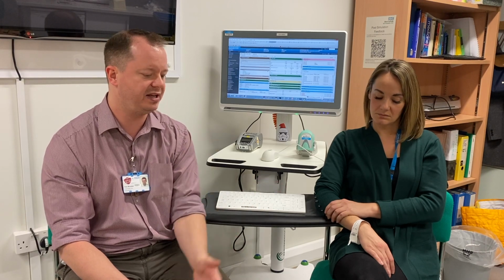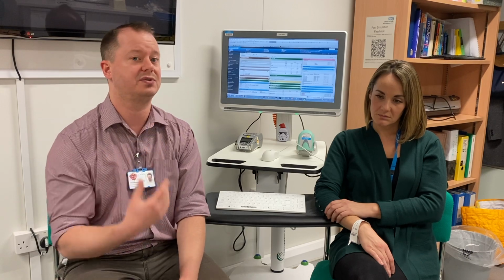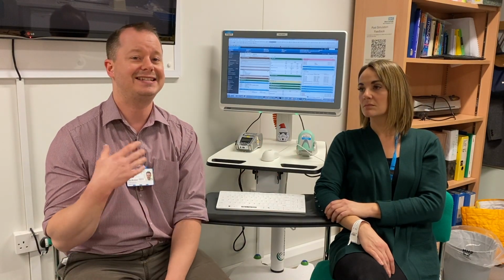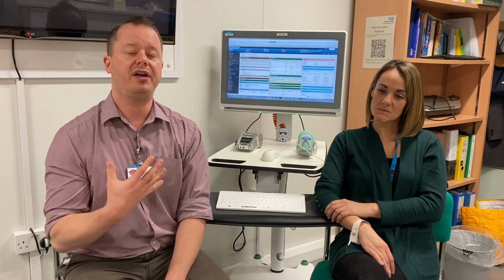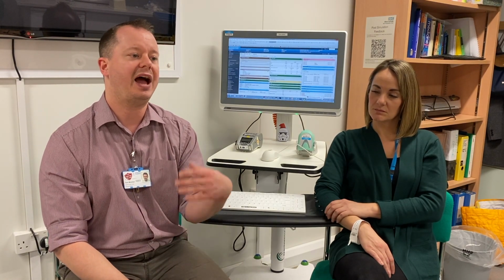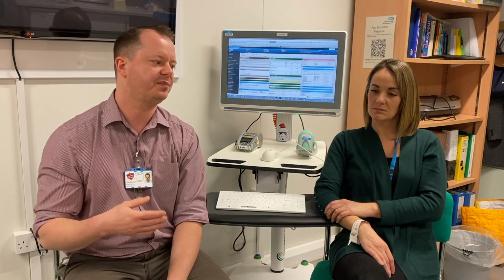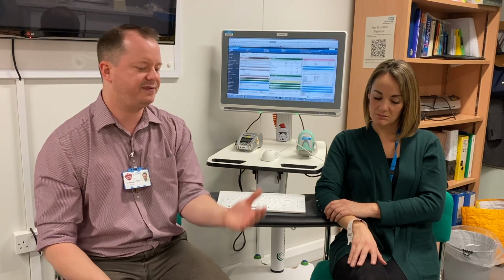If you are going to be trying to perform any practical skill, you obviously need to introduce yourself to your patient, you need to state your role, you need to say why you're there and possibly offer an explanation of the practical procedure you're going to be performing, and then gain consent. And that is the same for any practical skill you do. Once you've got all that, you can then identify the patient correctly.